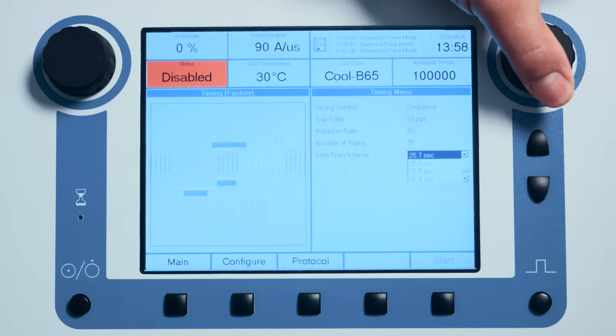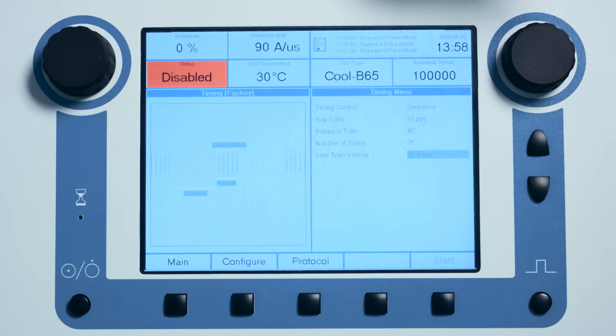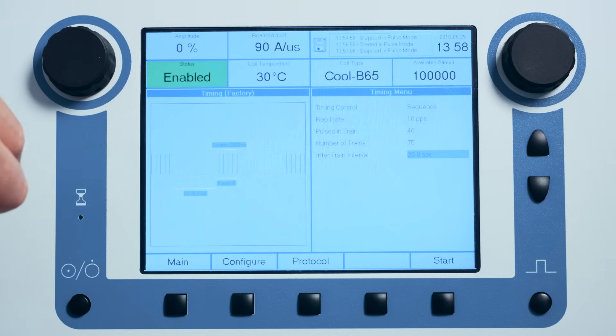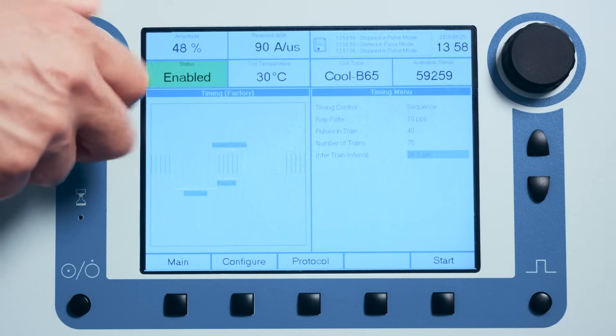Once the correct settings have been selected, enable the stimulator, set the correct intensity — which is 120% of the motor threshold value — and initiate a treatment session by depressing the start button.